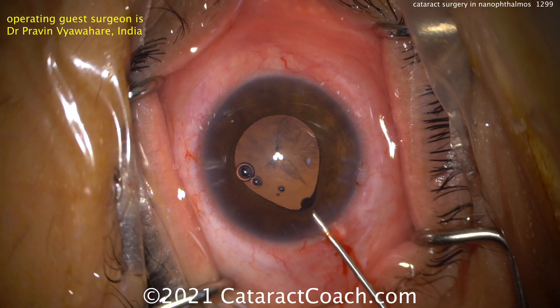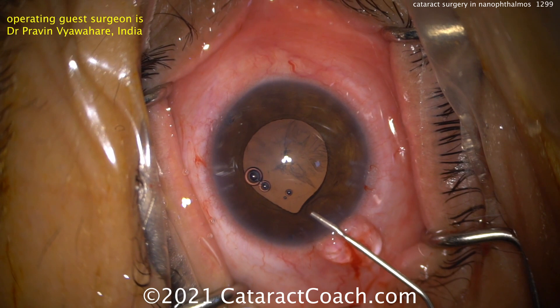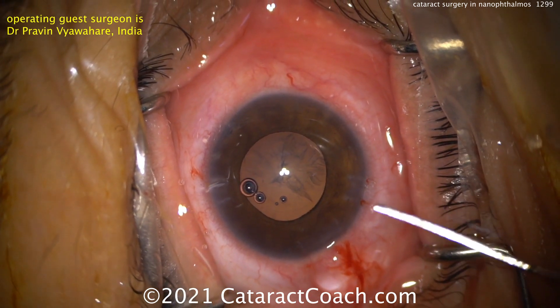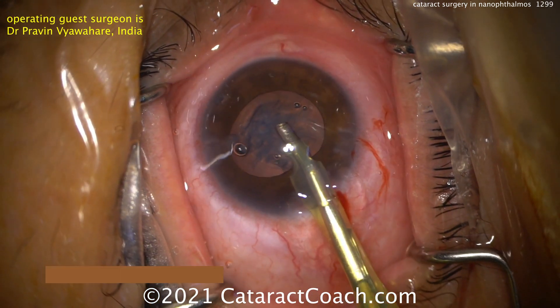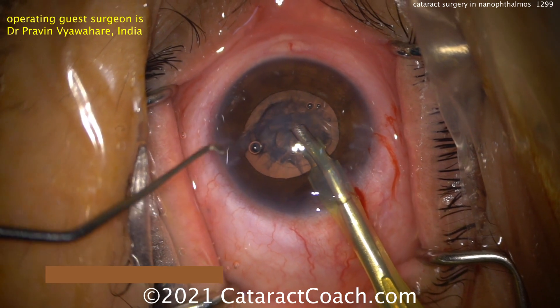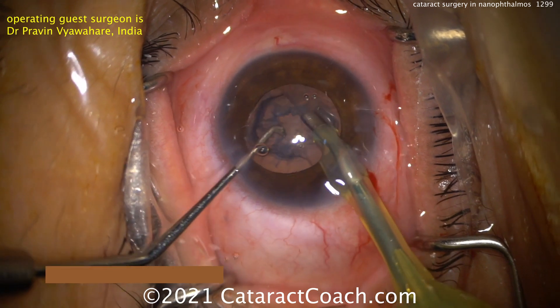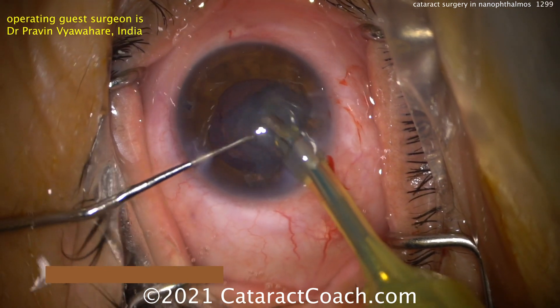Put a little more viscoelastic in, but this is a tough case. The whole case is going to be like that — the iris is going to want to prolapse. Make sure you're not too tight on the speculum. Also remember, this patient has a risk of choroidal effusion, even choroidal hemorrhage, and you have to be very careful to avoid that. Luckily this nucleus doesn't look too dense, so it should aspirate out reasonably easily — just take your time.